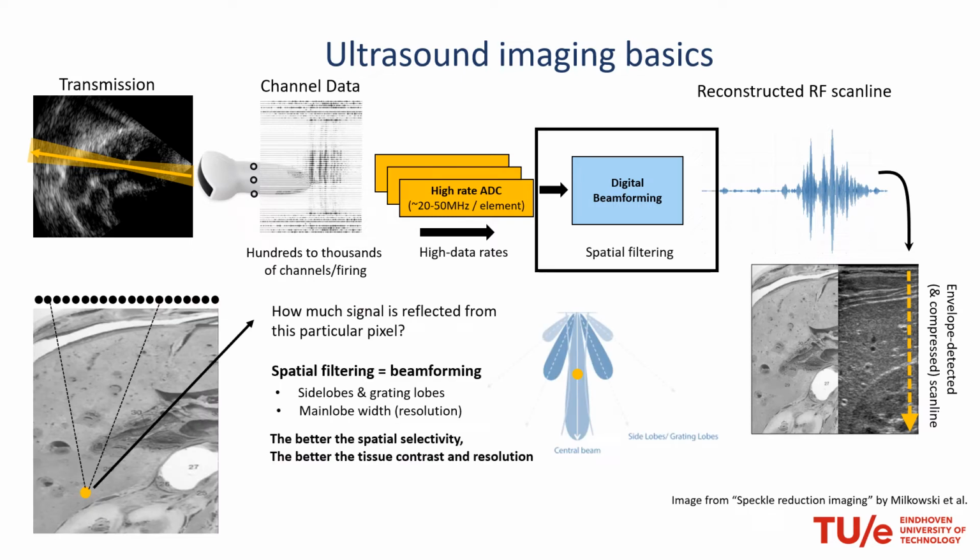Now the question is, how much signal is reflected from a particular pixel? Because that is what you want to do in digital beamforming, right? So in digital beamforming, the goal is to do spatial filtering. So you want to know how much signal is reflected from a particular pixel.